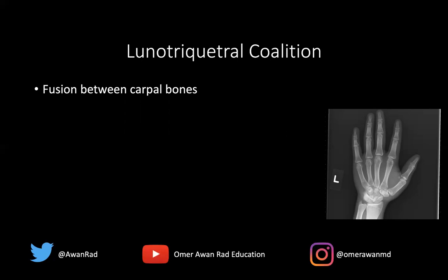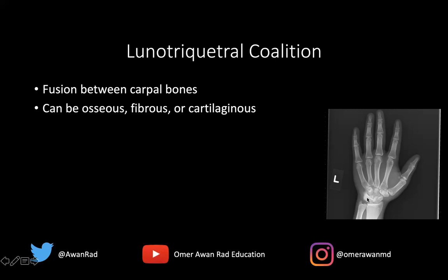We're talking about fusion between carpal bones. Just like in the ankle, this can be osseous, fibrous, or cartilaginous. In this case it's an osseous coalition because we have frank bone bridging both bones together. They can certainly be fibrous or cartilaginous — we often link fibrocartilaginous together because it's very hard on imaging to differentiate a fibrous from a cartilaginous coalition.